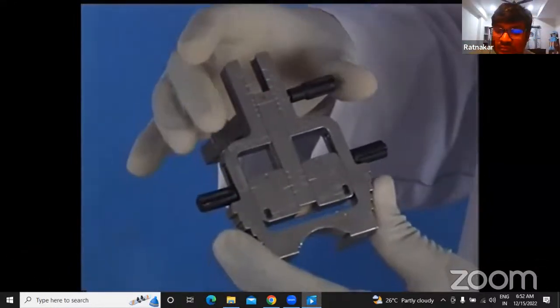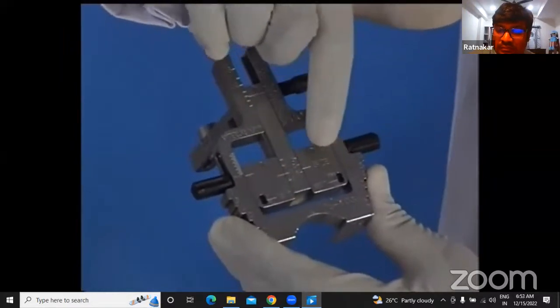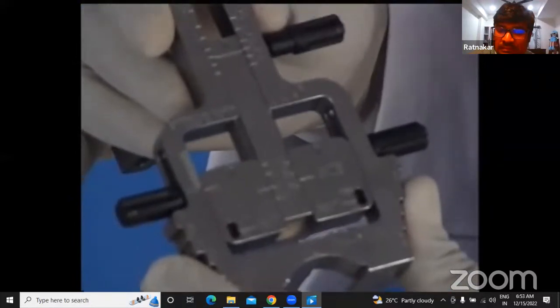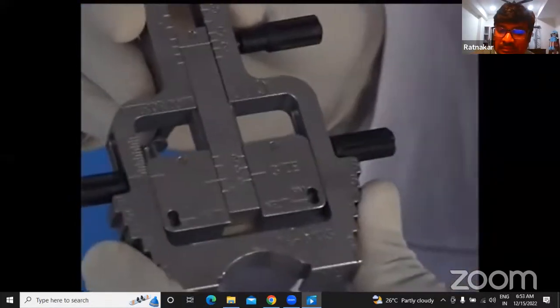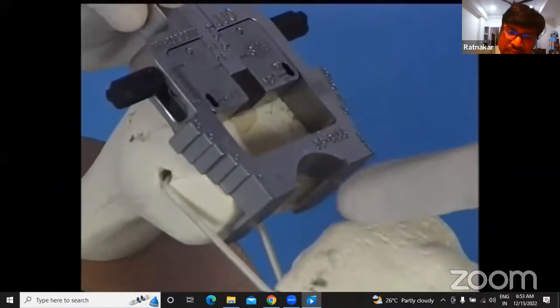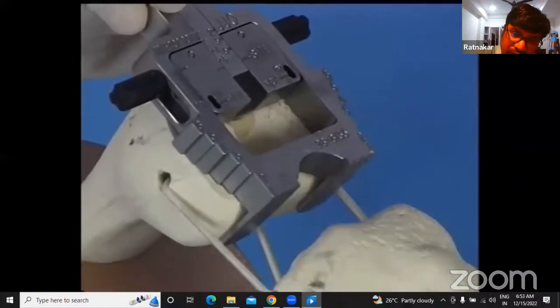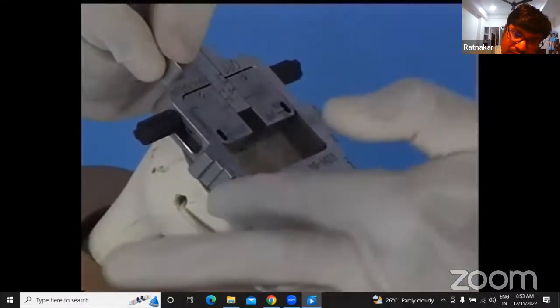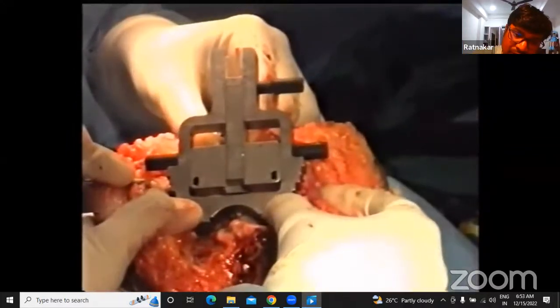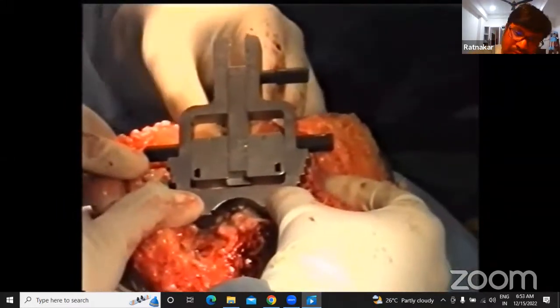Besides the size of the femoral component, it dials in 3 degrees of external rotation on the femur, which is very important for patellar tracking and for good alignment. I will show you how to use this instrument. The legs of this jig should touch the posterior femoral condyles on both sides, a snug fit. If your femoral cut is right, then this also should be a snug fit to the cut. Now this is flush to the distal femoral cut surface, and we will see the sizing.